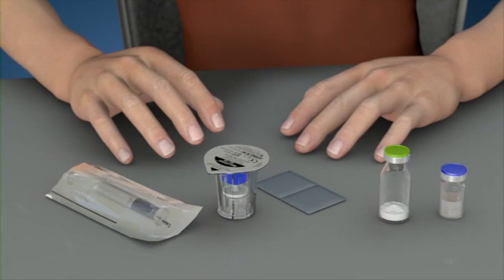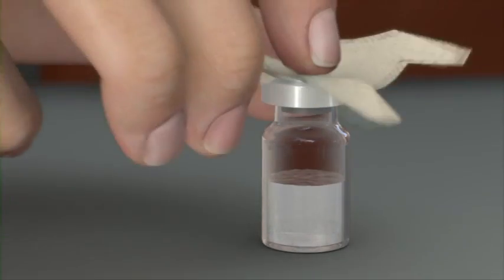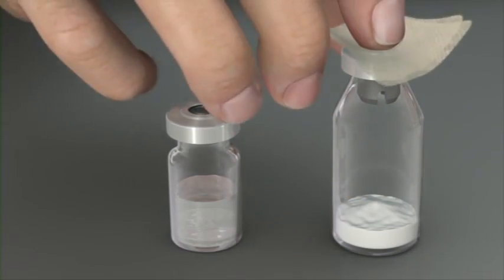Begin by ensuring that the product and sterile water or diluent vials are at room temperature. Carefully remove the protective caps from the vials containing powder and the diluent, and clean the exposed rubber stoppers with an appropriate antiseptic swab and allow to dry.